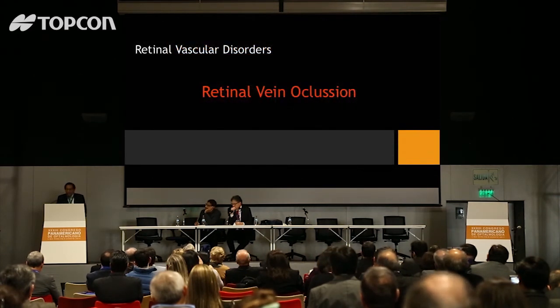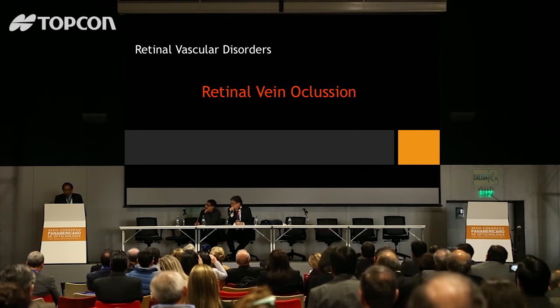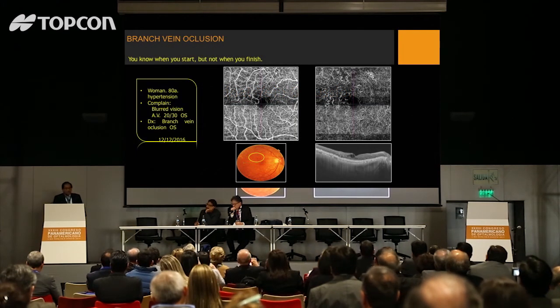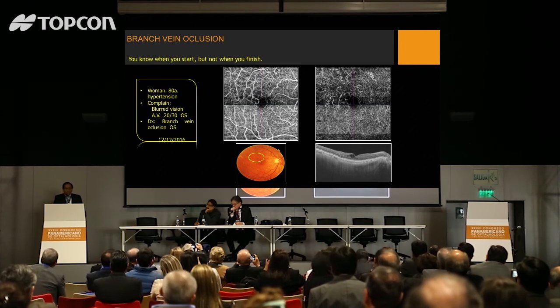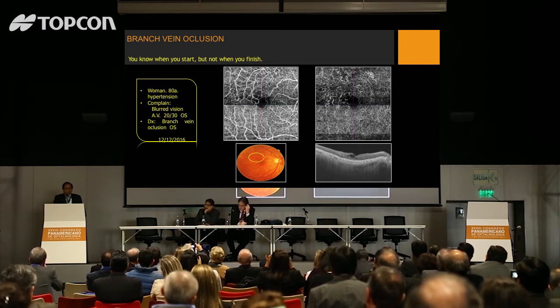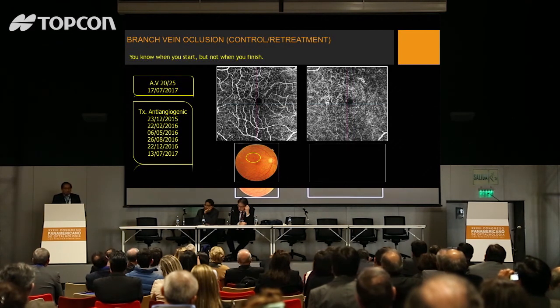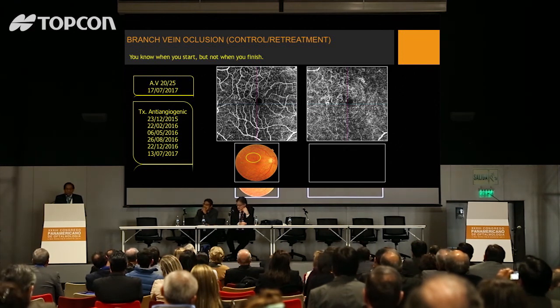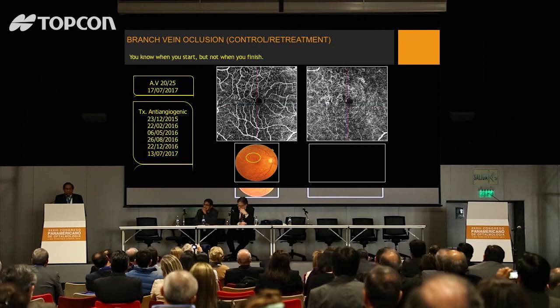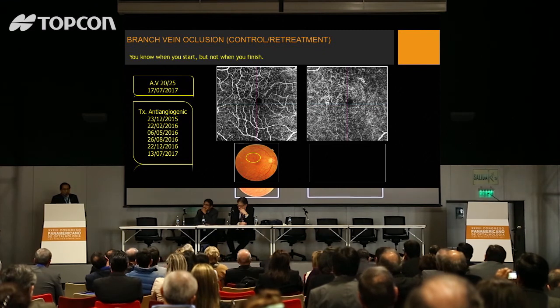Y como se ve, no se puede ver el plexo con la angiografía fluroceínica. Esta es la evolución después de recibir inyecciones antiangiogénicas. Y como ustedes pueden ver, casi se recupera totalmente la estructura del plexo superficial y profundo. Este es otro paciente que venía por flotas, con una visión relativamente buena. Pero miren el grado de isquemia y proliferación que teníamos. Y este es el nuevo software que permite hacer estos mosaicos, en los cuales podemos extendernos hasta cuatro o cinco campos y formar imágenes completas del fondo.